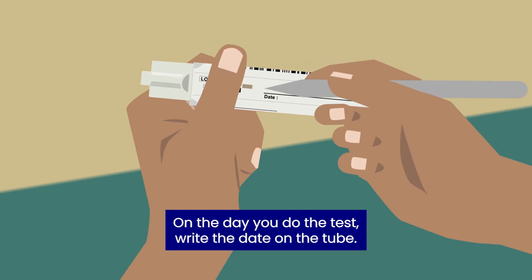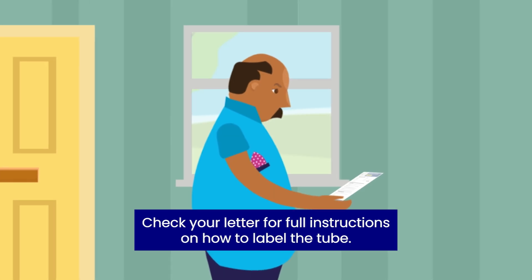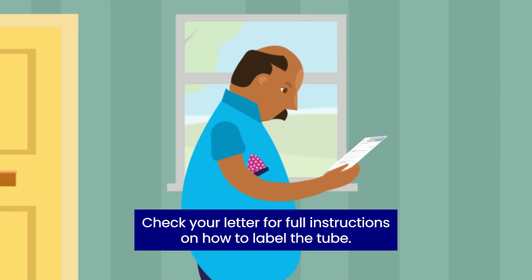On the day you do the test, write the date on the tube. Check your letter for full instructions on how to label the tube.